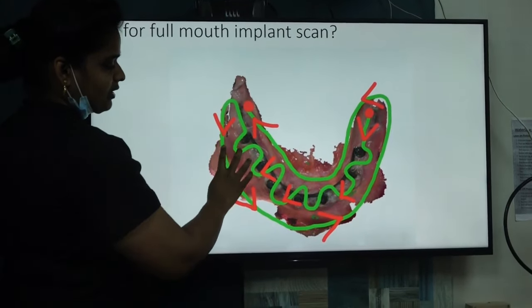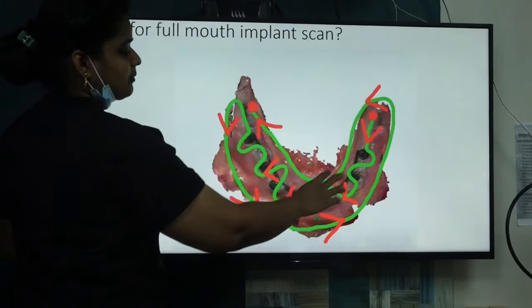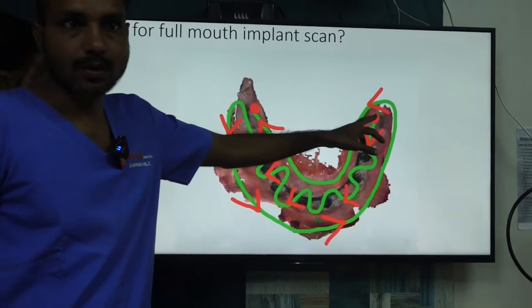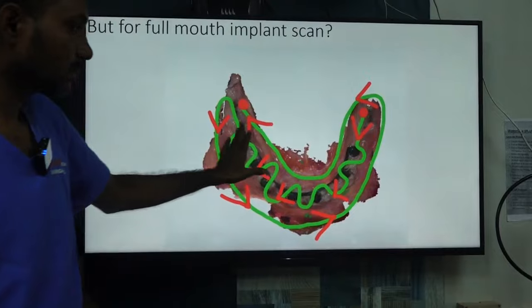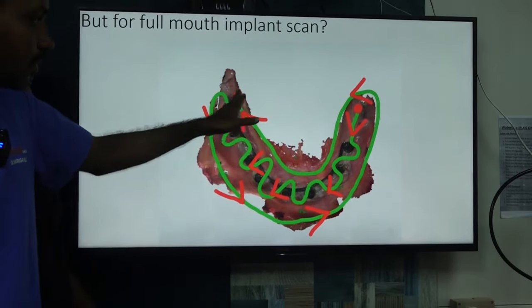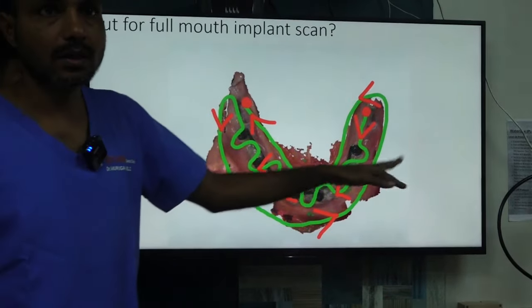If you are coming buccally, you have to scan carefully. Then reach the opposite side retromolar, then come and scan the lingual. See, start from the occlusal aspect of the distal molar, jiggle both buccal and lingual, finish the full arch. Then you have the freedom to go lingual and then buccal, or finish buccal or lingual.